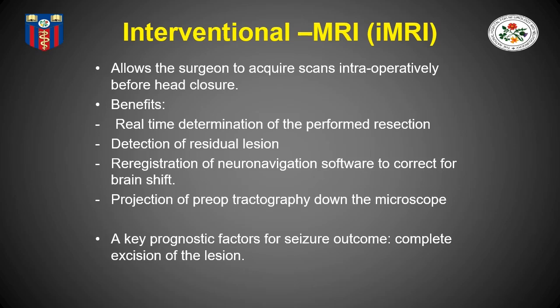Clearly, in pathologies such as epilepsy, when it's lesional epilepsy, or even MRI negative cases when you have to make sure that you have achieved a complete resection, iMRI is essential because it gives you at the time of surgery the certainty of your complete resection.